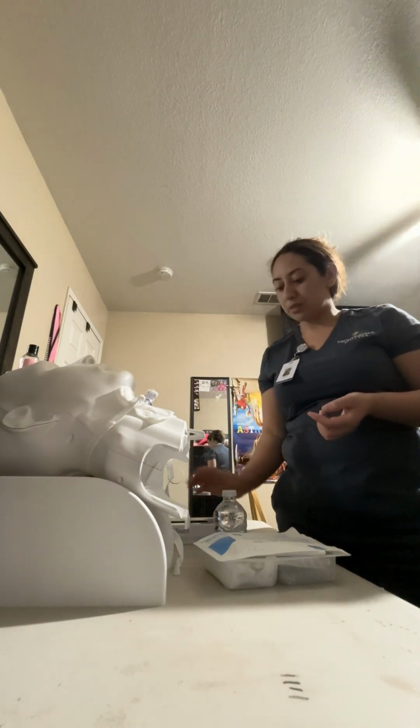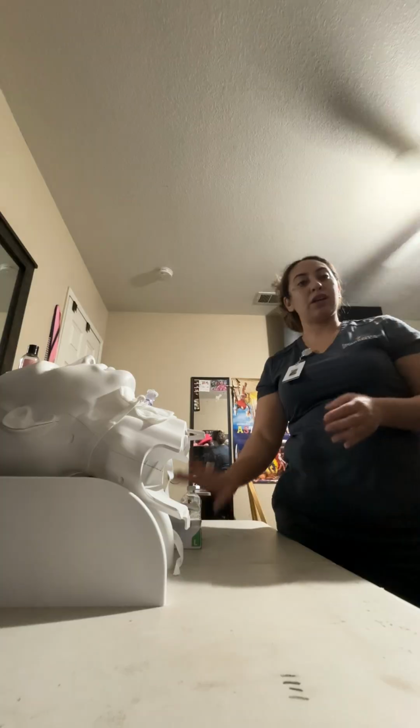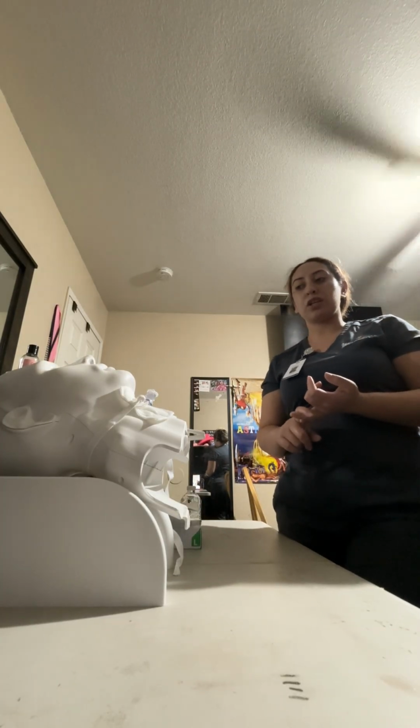For tracheostomy care, I'm going to first obtain doctor's orders. I'm going to read over those and verify that the information is correct. I'm going to go to the patient and identify myself. I'm going to have the patient verify their name and their date of birth for me. I'm also going to check their wristband to assure that this is the correct patient.